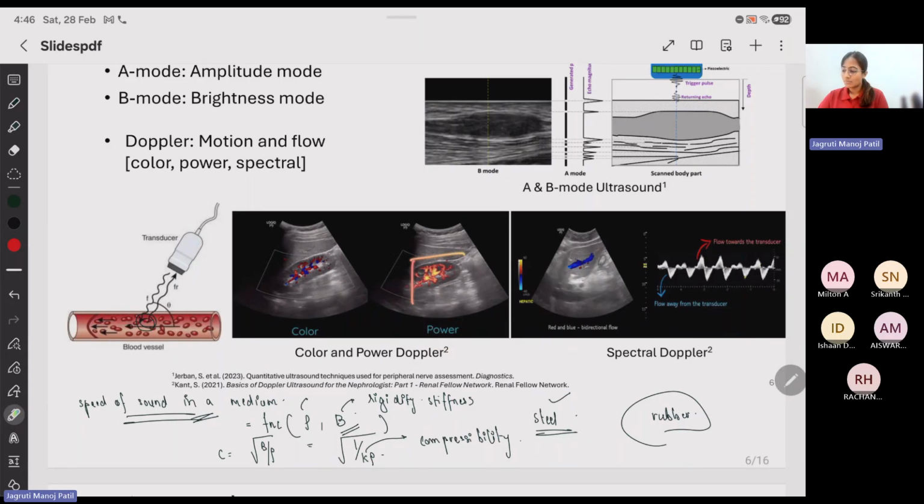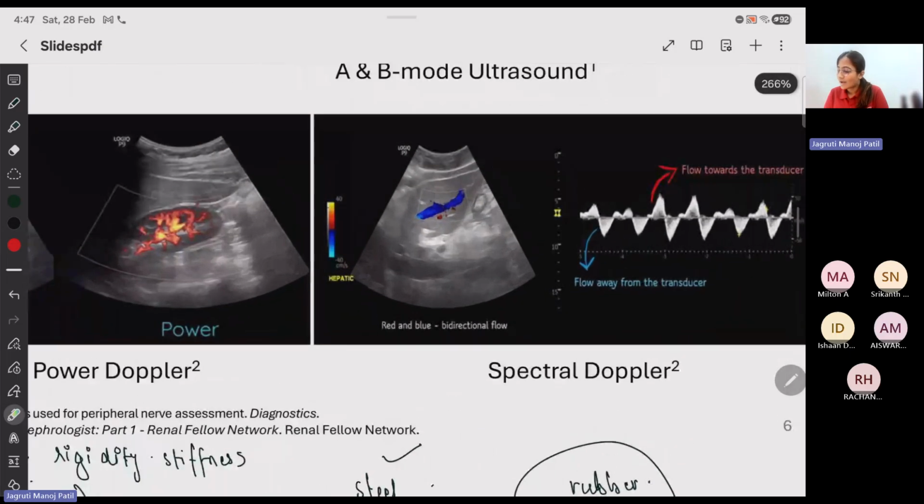So this type of imaging mode is very sensitive to slow flow, or slow flow tissue and organs wherever you want to see through them. It tells you about the intensity of the blood flow. And then the other one you have is spectral Doppler.